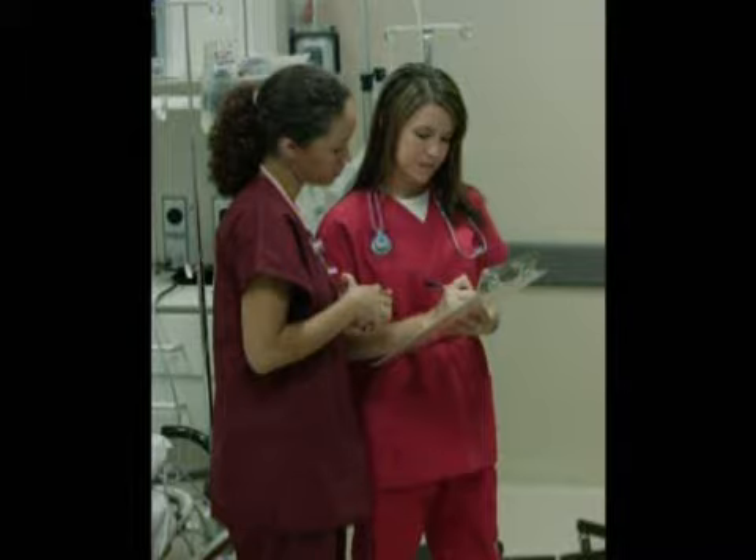You'll also be aware of previous glucose testing results for the client and compare the current result with them, taking into consideration any treatments and medications that might influence glucose levels. Also, be sure to assess the puncture site on your next visit to the client's room.